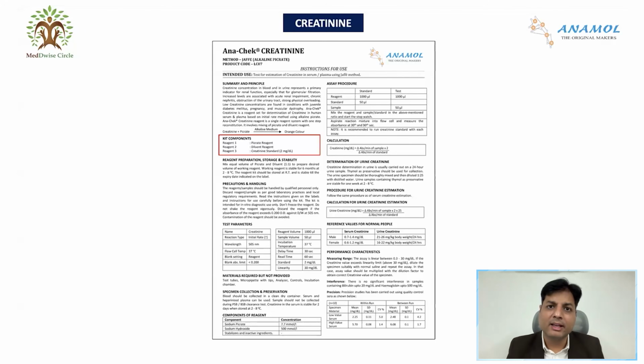Some people call this IFU as pack insert. Some people call this IFU as literature. Some people call it as kit literature. But essentially, all these terminologies are the same. They are meant for the user or the consumer. Whoever is consuming the test, whoever is using the kit, that particular person needs to read and understand this pack insert before using the product.